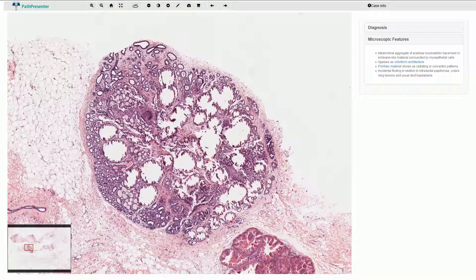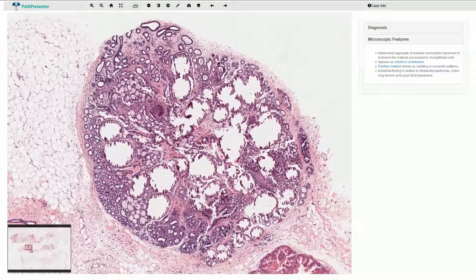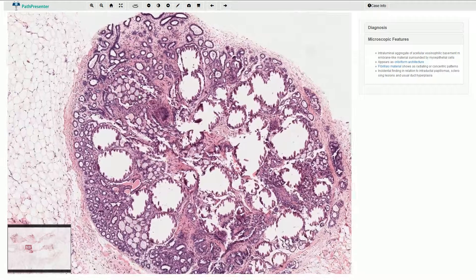It is a benign epithelial proliferation made out of luminal cells and matrix producing myoepithelial cells. It is really important not to misdiagnose this lesion as ductal carcinoma in situ or adenoid cystic carcinoma.